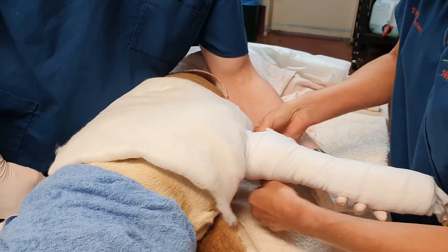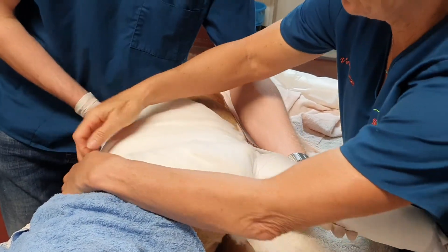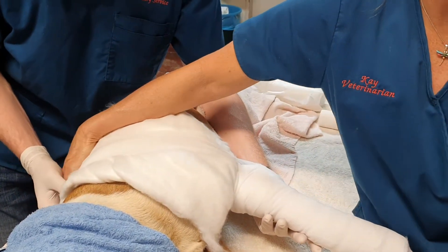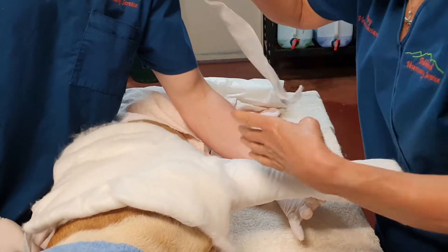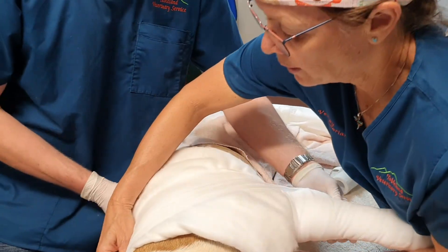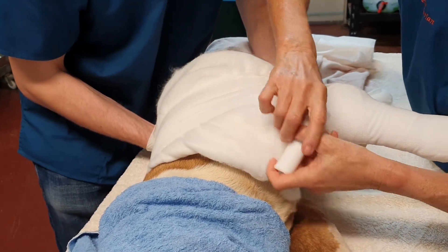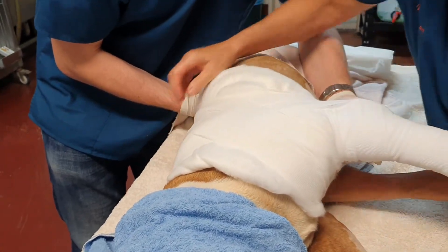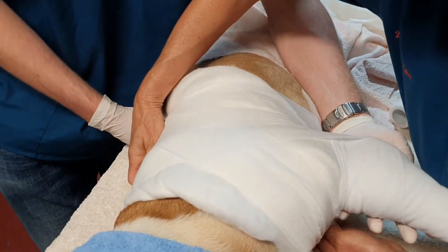When we get to this part, we need to go over the body, and we're going to be zigzagging. So I'm going from behind the elbow, forward, around the body, and then in front of the elbow towards the back, and then once again behind the elbow. We criss-cross it so the whole lot gets covered, from behind the elbow to in front of the elbow.